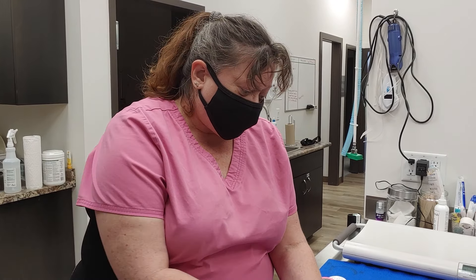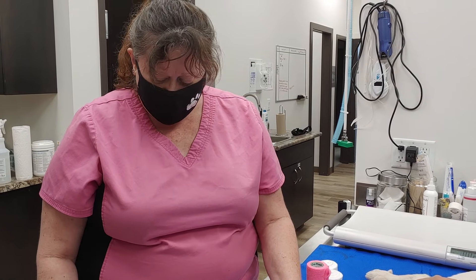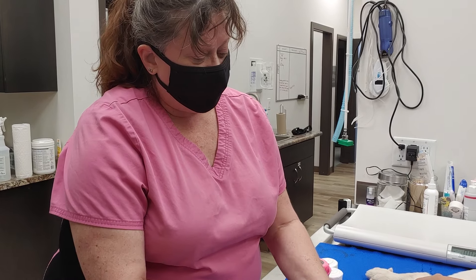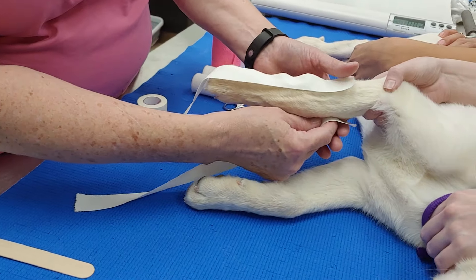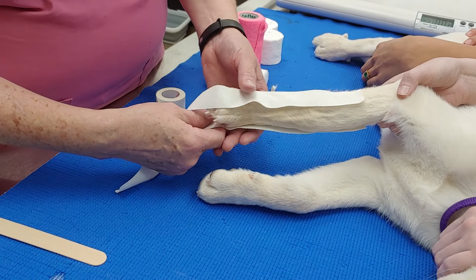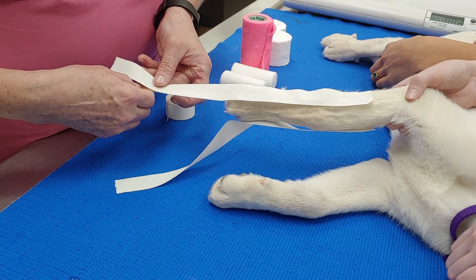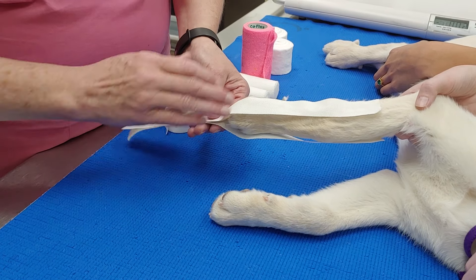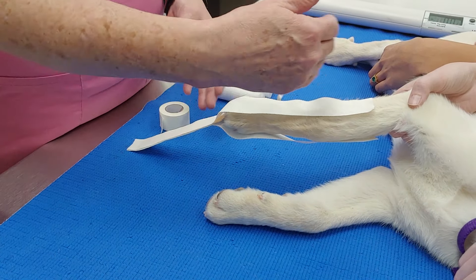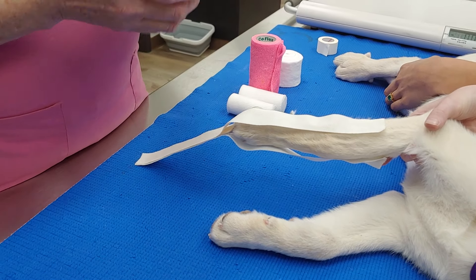We're going to be doing a bandage change on a dog that's got a broken leg. At the moment, I'm applying stirrups to the leg so that once we actually put our bandaging material on, it'll keep the bandage itself from sagging down or shifting too much on the leg itself.